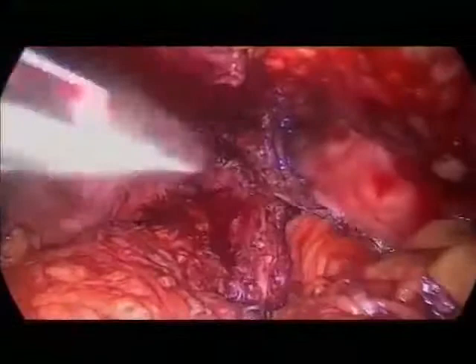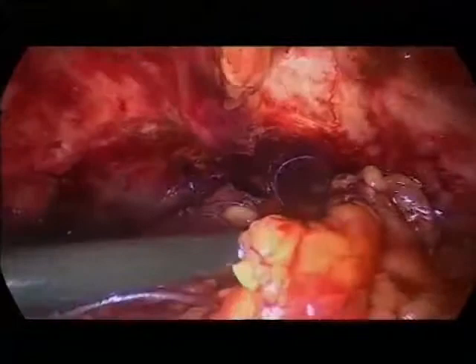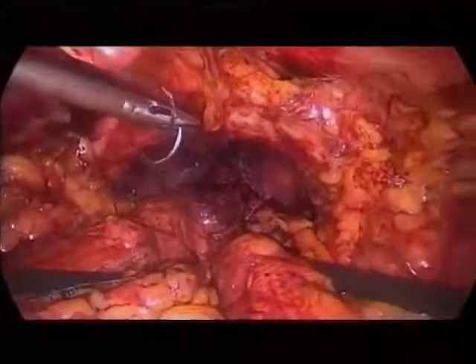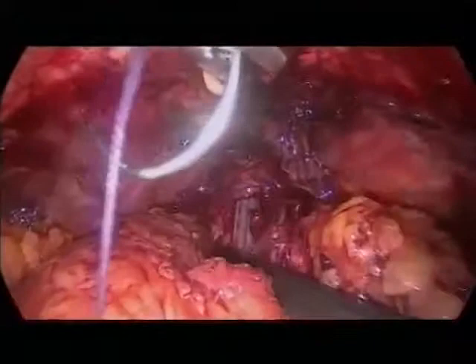Are you doing a cystogram routinely? Yeah, we do it. Can do it under vision, but you know, I was sure that there is no problem with the anastomosis. Of course, you should do it under vision. That's for sure. But okay, come in, suction show, please. Okay, now it's very nicely to see.